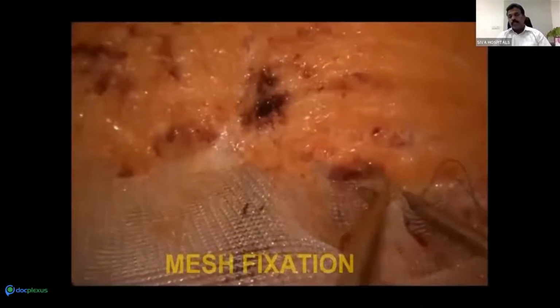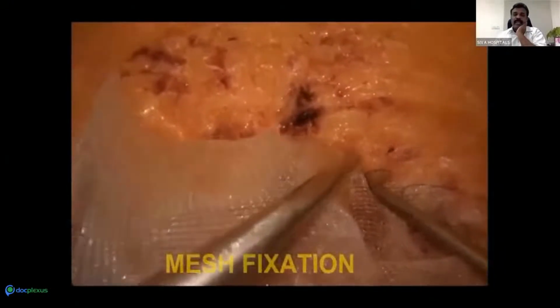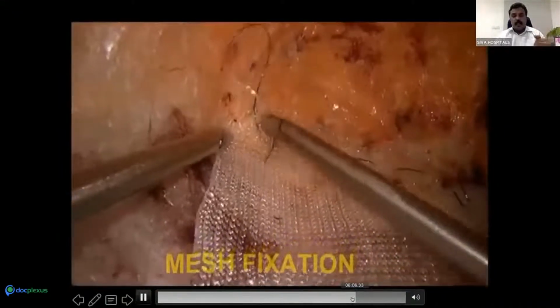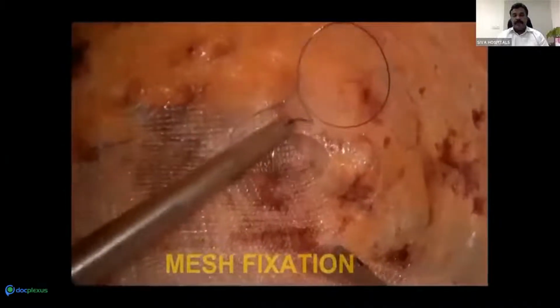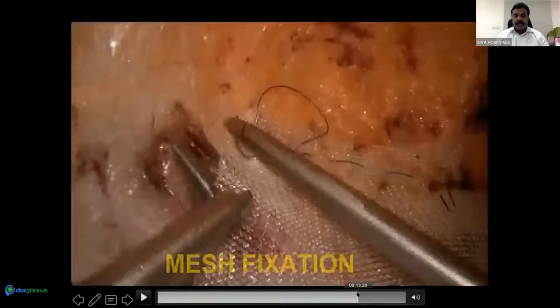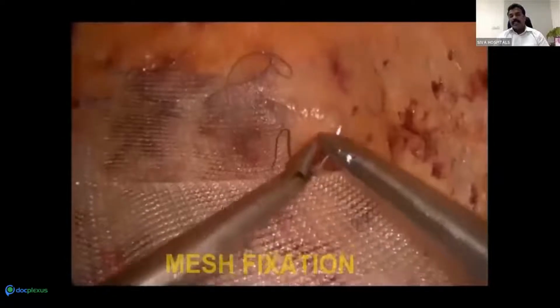Now for fixation of the mesh, I use 2-0 Prolene. Take a continuous suture from the right upper end to the patient's left hand side. Start a continuous suture and come down on the left side. When you complete the left side, then on your right hand side also start the continuous suture.